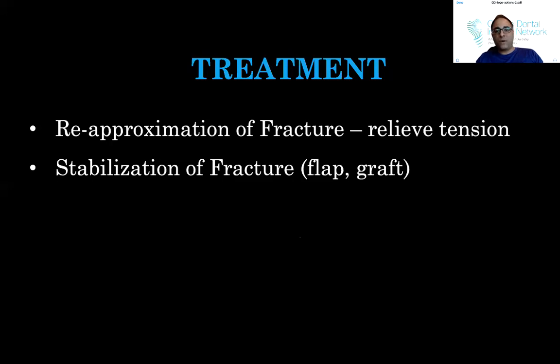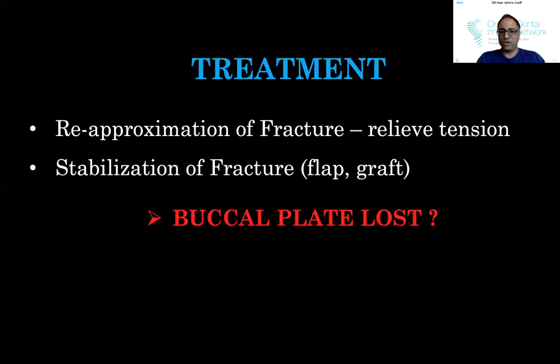Okay, stabilizing the fracture. So whether we're just using the flap to stabilize the fracture and reapproximate things, or whether we actually have to incorporate bone grafting material, and in some cases tacks or screws to stabilize it. Okay, and again, these are larger fractures.